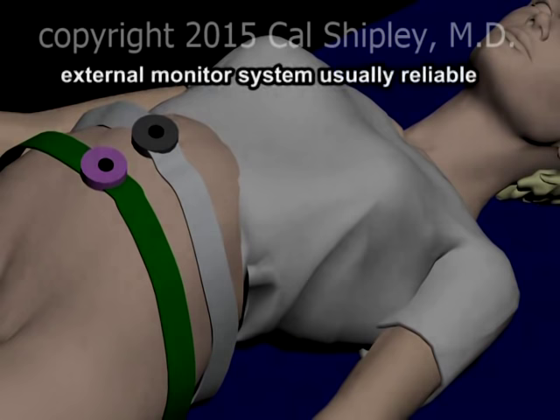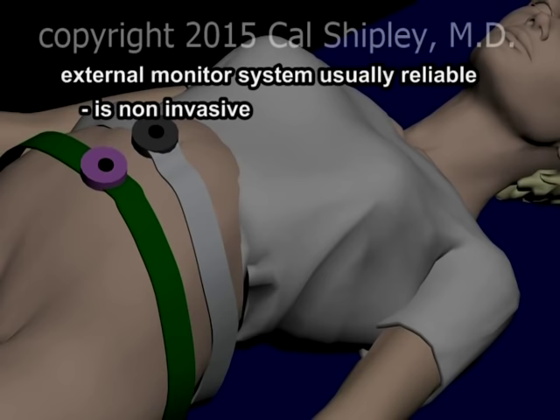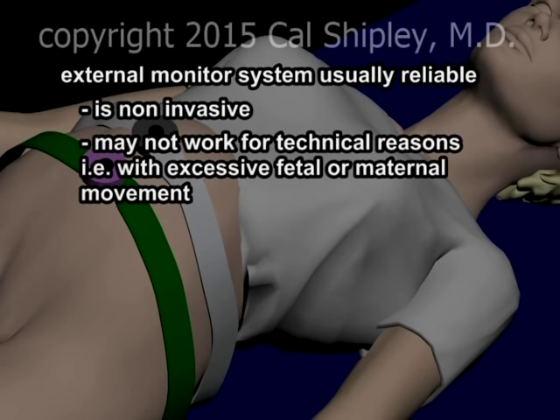Most modern fetal heart rate monitoring equipment also outputs a sound component, changes in which can alert the delivery room staff to problems with fetal status. The external monitor system discussed thus far is generally very reliable for obtaining an adequate FHR tracing, and it has the advantage of being completely non-invasive — in no way detrimental to the fetus or the mother. In some instances, however, such as when there is excessive fetal or maternal movement, the external system may not yield a readily interpretable tracing.